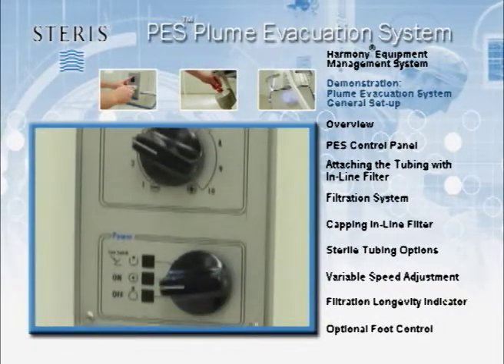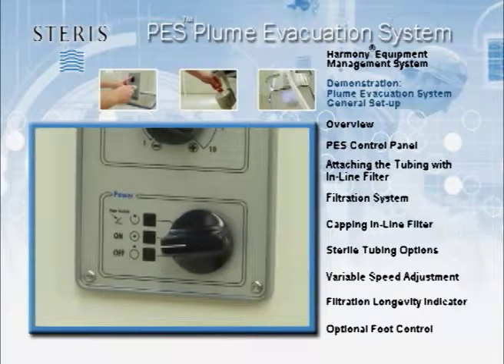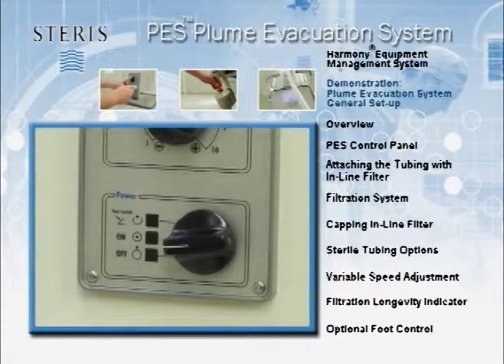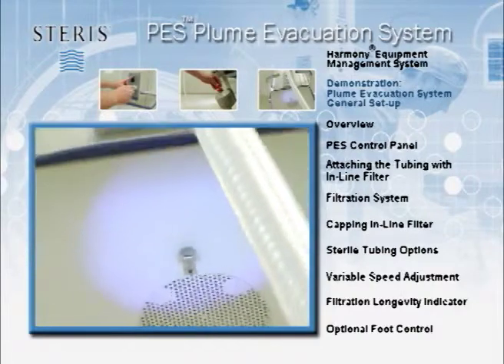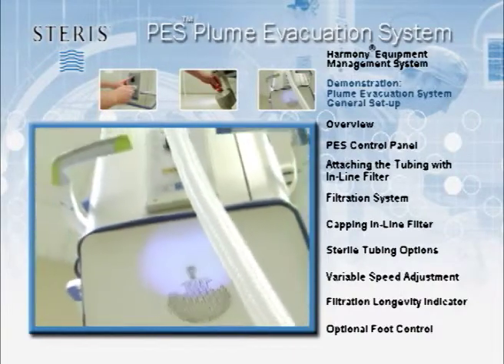An optional foot control will permit the flow of suction to be controlled via a foot pedal. This option will allow hands-free operation with intermittent activation of the smoke evacuation. The port for the foot pedal connection will usually be found on the underside of the Harmony EMS unit.